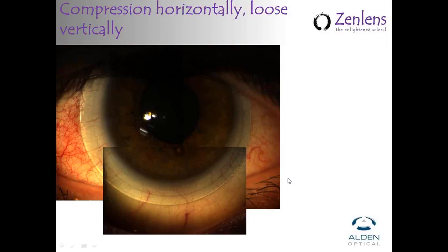John, can you go back to the left side? Can you take your cursor and put it at the inferior view there? And the vessel on the left side, the real bold vessel that comes through, can you see how there's just a little bit of deflection of that vessel as it hits the edge of the lens? You see it shift? That's a good indication that that edge is a little bit loose. It's probably lifting away from the eye just slightly, and that's causing that deflection in the course of the vessel. It's an optical thing. It's not a true movement of the vessel, but the lens lifting off, the optics of the lens cause a shift in the visual of that vessel, and that's another way to look and see if a lens is a little bit loose.